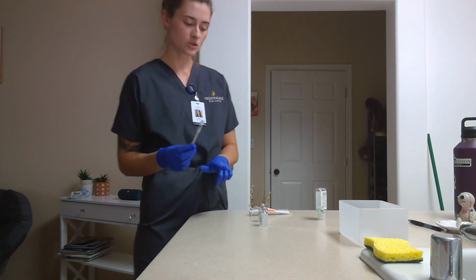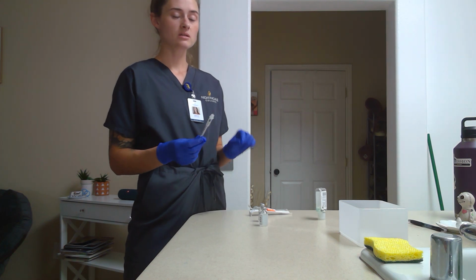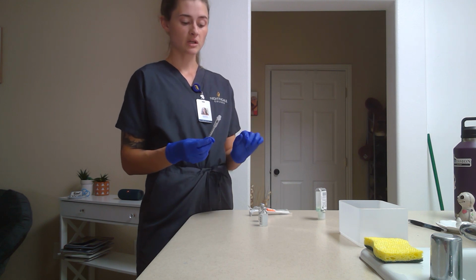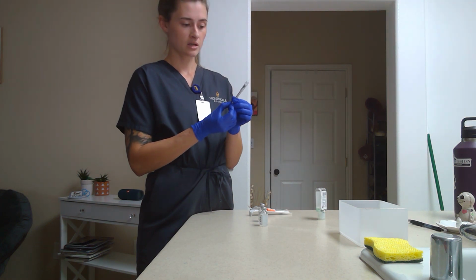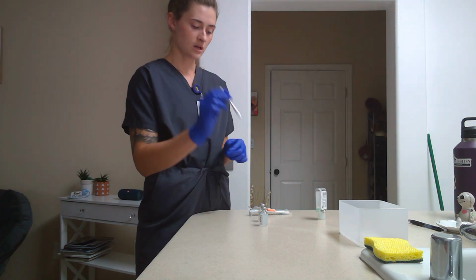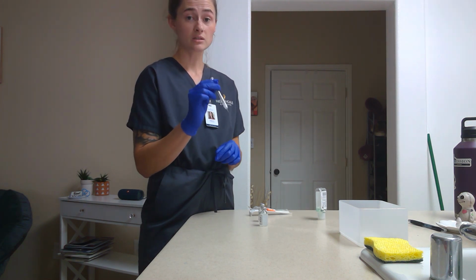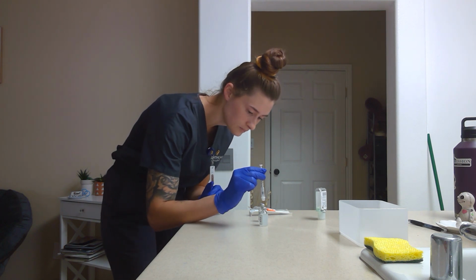Because I am going to actually be drawing up my regular first, I need to start by putting air into NPH first, because NPH I will be drawing last. So I'm giving 8 units of NPH. So I'm going to draw back 8 units on my syringe here. Once I have that, I'm going to inject it into the NPH, making sure that the needle is not touching the NPH insulin.